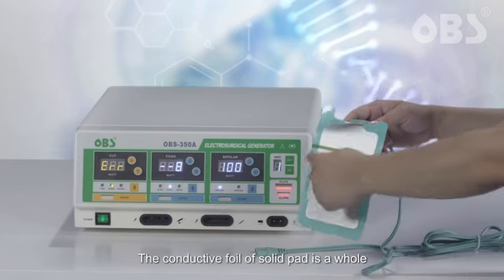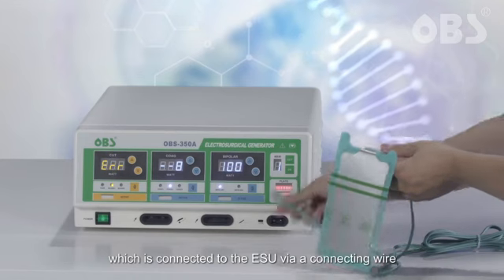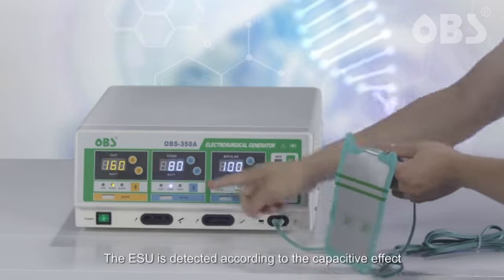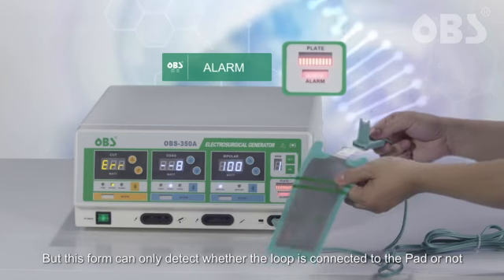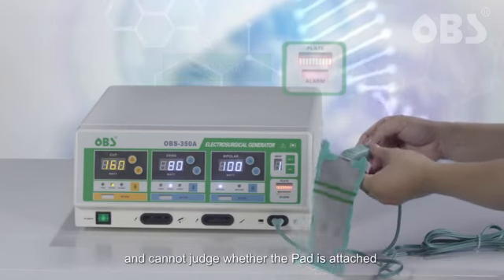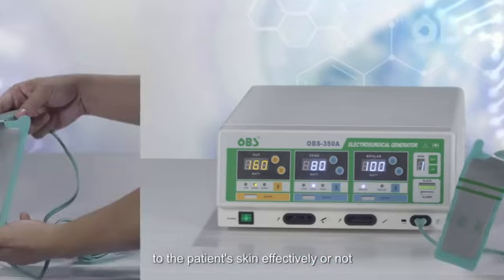The conductive foil of the solid pad is a whole piece, which is connected to the ESU via a connecting wire. The ESU detects according to the capacitive effect, and an alarm sounds if there is no connecting circuit to the pad. But this form can only detect whether the loop is connected to the pad or not, and cannot judge whether the pad is attached to the patient's skin effectively or not.